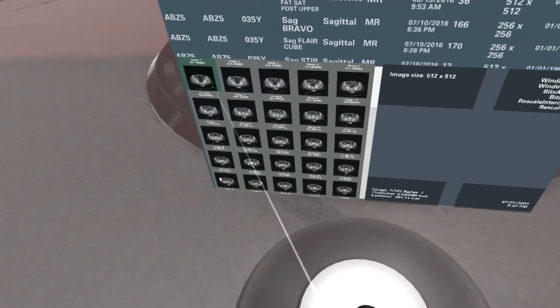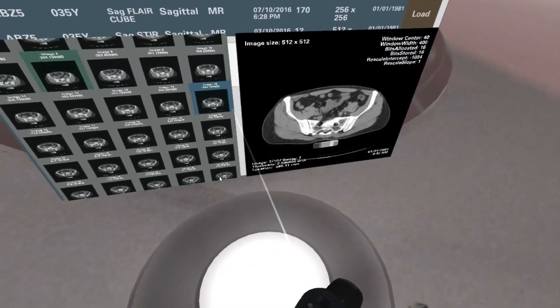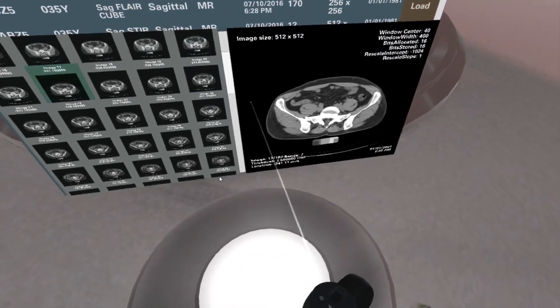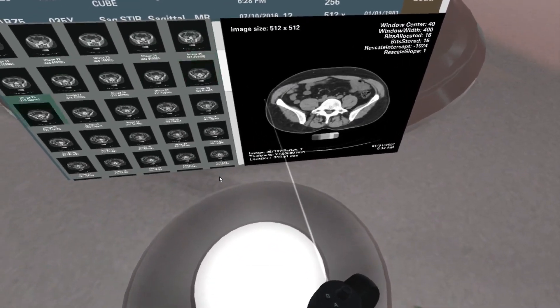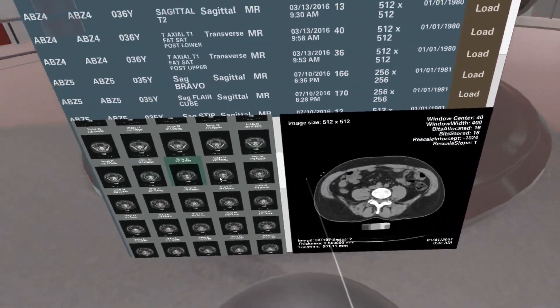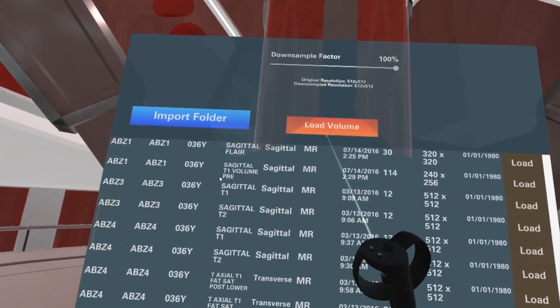You can import your own DICOM files and watch as they are converted to 3D volumes in real time.